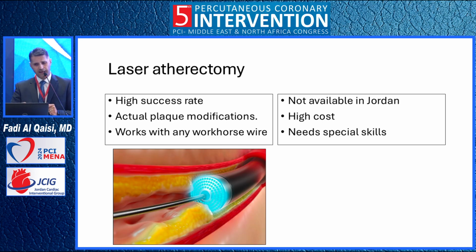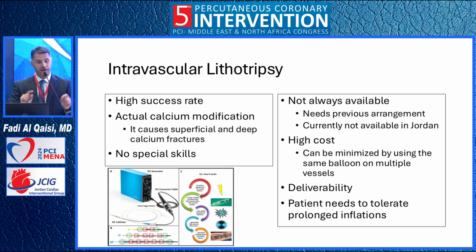Laser atherectomy, high success rate, actual plaque modification. It can work with any wire. It doesn't need a special wire like the other two devices. It's not available in Jordan, and it's high cost, needs special skills.